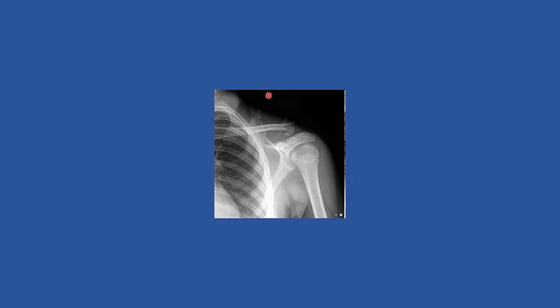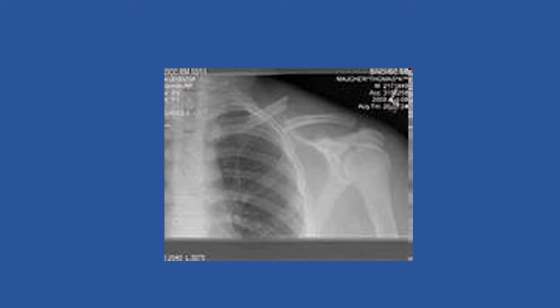This case is very different. This is a distal third fracture. It's kind of out of place. So that patient is going to need a more urgent evaluation by orthopedics, just because they might need to have that repaired. This is an example of a tenting X-ray, kind of sticking up almost through the skin. This is an X-ray that shows a fracture that probably should be evaluated fairly urgently by orthopedics.